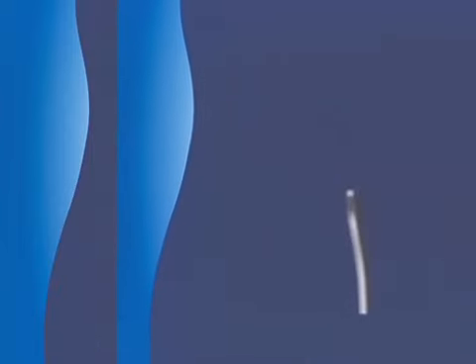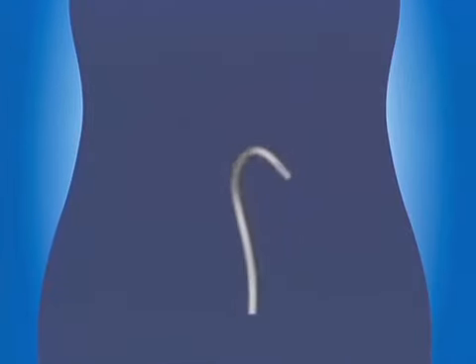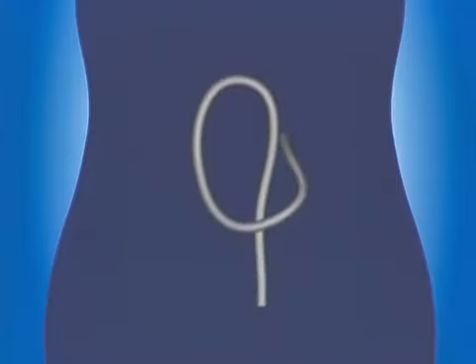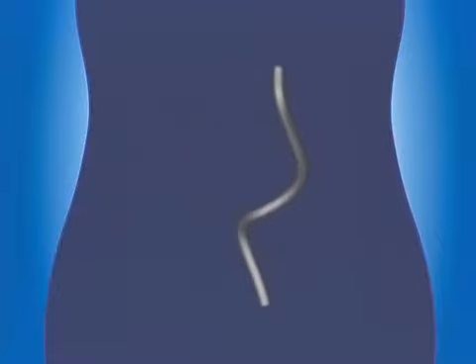Let's look now at some of these sigmoid loops as recorded on the 3D imager. This is an N or spiral loop. See how mobile the sigmoid can be. Here's an alpha loop forming, and now the loop is being straightened by pull back and clockwise torque.